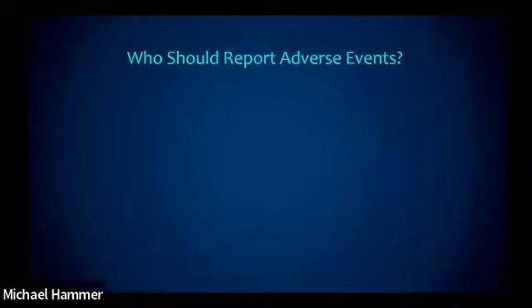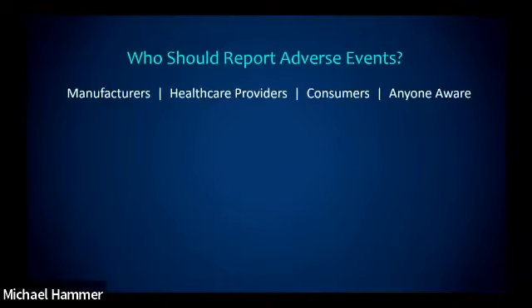Who should report adverse events? Shout out. I wanted to do a little polling thing, but I just didn't get around to that. Who should report adverse events? Oh my God, you guys are so smart. Okay. I think that just sometimes there's a misconception that there's a limited number of people: only the manufacturer can report adverse events, only the healthcare provider, only a doctor. Anybody that is aware of an adverse event has the opportunity and the responsibility, in my opinion, to report that adverse event. And again, we'll go through some concepts of high reliability organizations and what we call just culture. I want to highlight that it's not intended to be punitive.